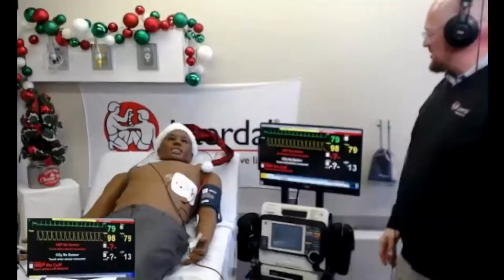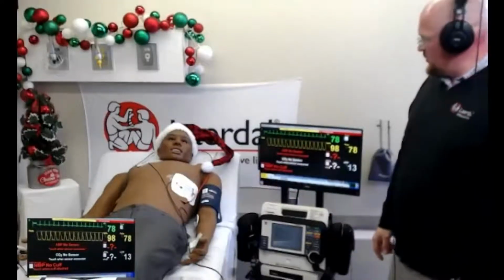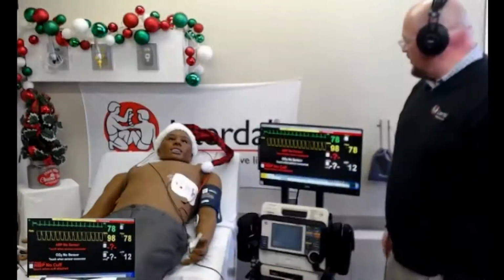So now we got a normal sinus rhythm. That shock was delivered, so that was all good. The next one that we're going to do is let's try some pacing. So let's slow you down there, partner.